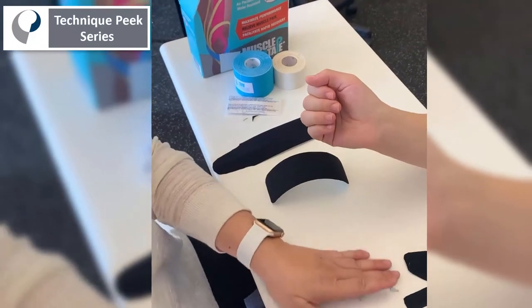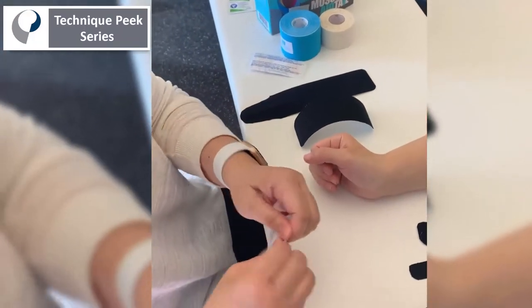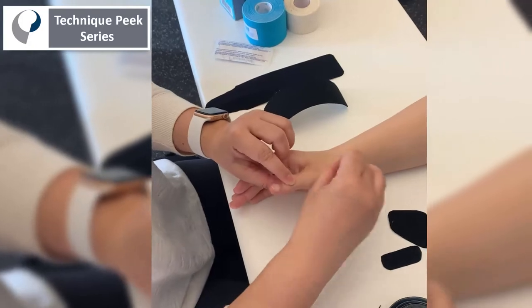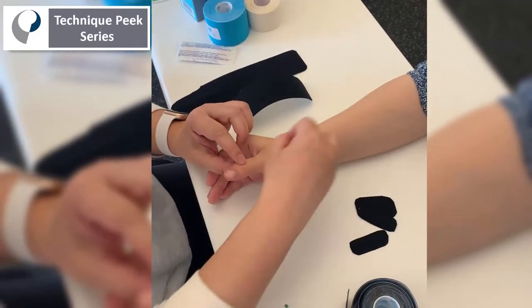Another trick to help the tape stay on longer is to clean the skin. Before taping, the patient washes their hands, and I also use an alcohol prep pad to clean all the oils off the skin.